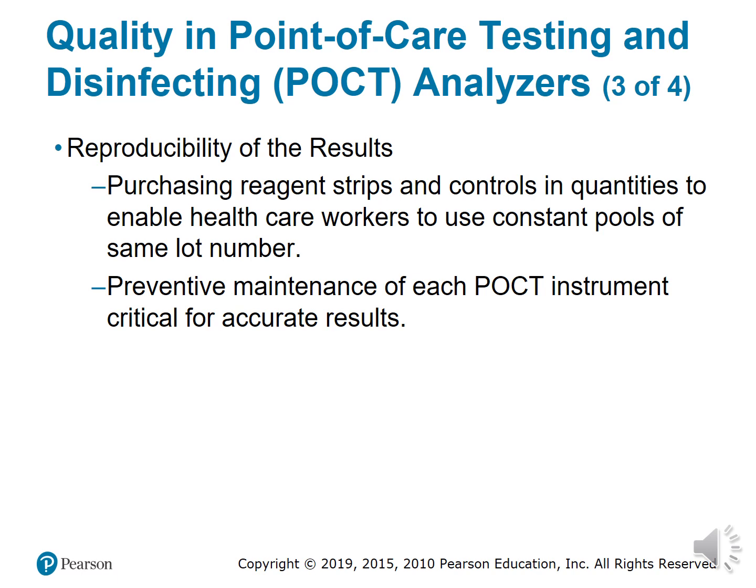Sometimes, especially if we're doing a quality control check, we'll pull one test strip from one batch and then pull another test strip from another batch to make sure that we get the same accurate results, or close to the same results, as we got with the last lot. Because if there is any discrepancy, we can throw that lot away and use the newer one.